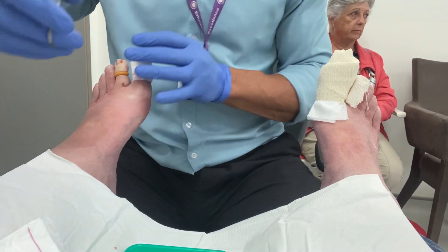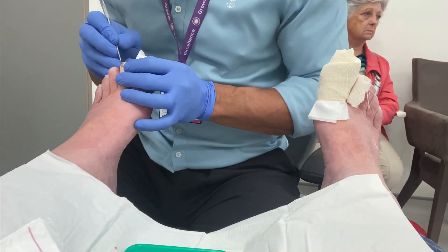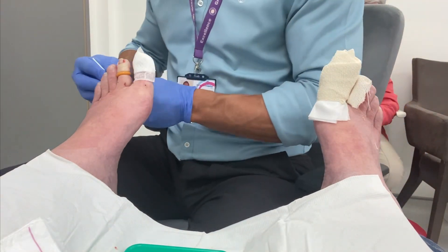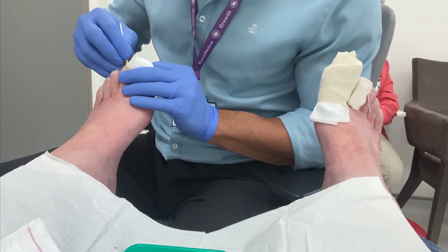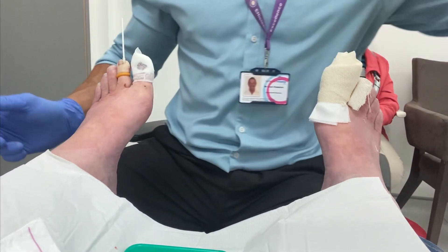I was really pleased at the end of this procedure on the lesser toe that I maintained enough nail plate to offer protection if the toe was stubbed or there was any trauma, but it certainly makes the procedure much more difficult when it comes to the finalisation.